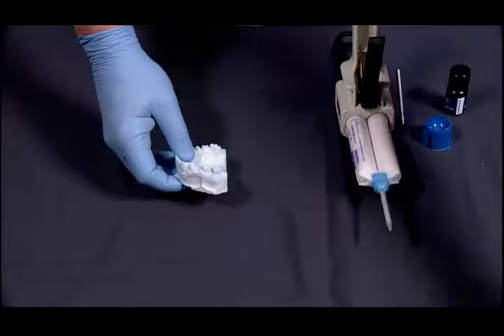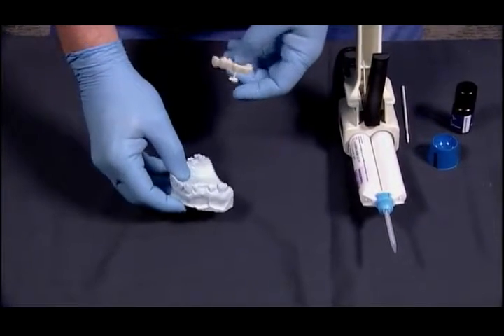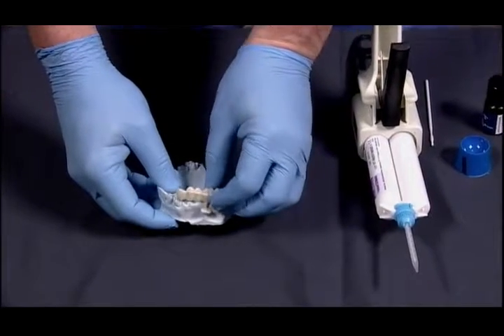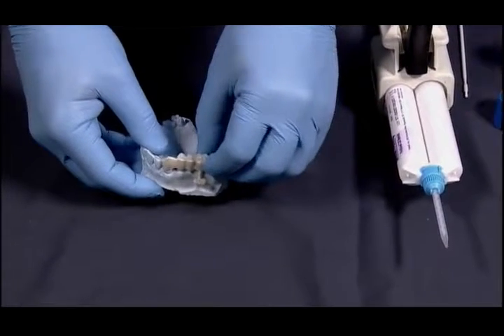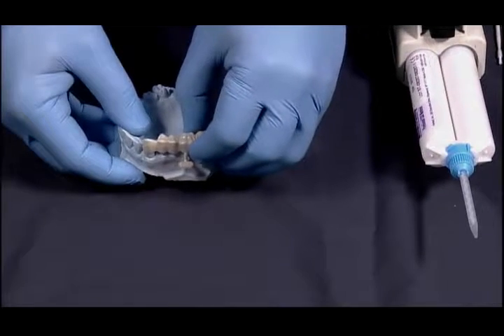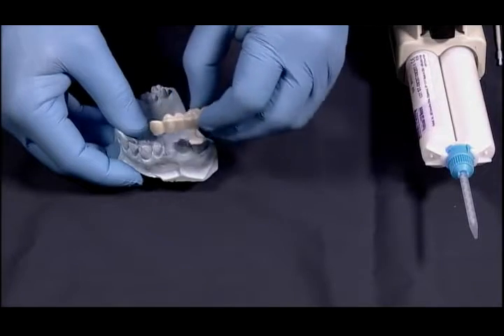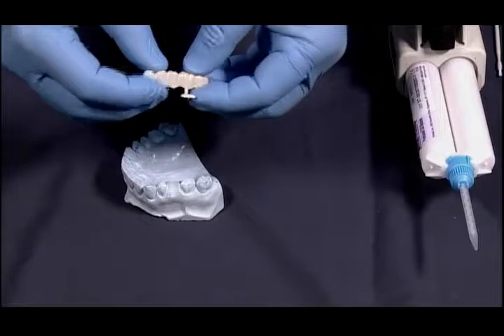So what we will do, we'll start out with the crown form. In this particular case, we're on the upper right, and we're going to go into the case and pull out the bridge segment for that side of the mouth. And you can see by this that it is oversized. So what we will do is go back and trim that so that it fits just this 3-unit bridge that we're dealing with today. I'm going to go back to the lab at this point.